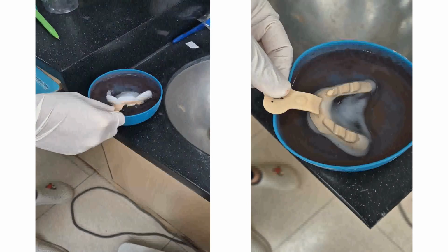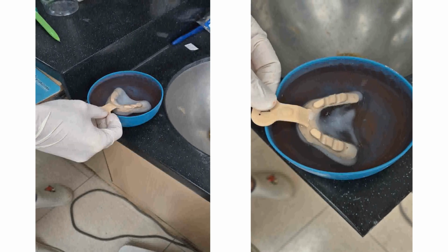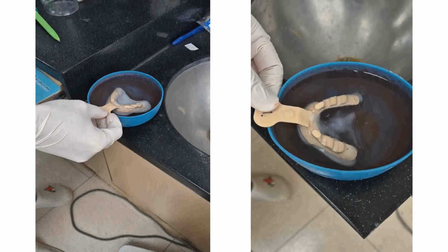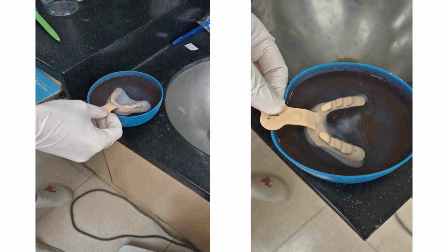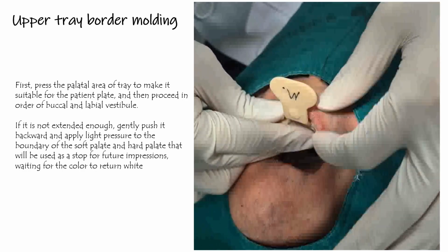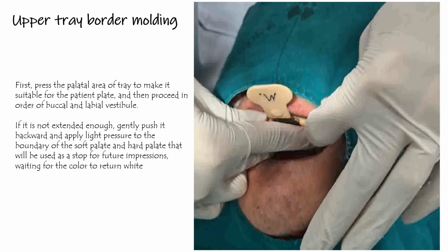When you place the JB tray in hot water, it softens in less than a minute at about 70 to 75 degrees Celsius. Please use the provided thermometer to ensure the water remains above 70 degrees Celsius. After about a minute, the tray becomes fully transparent, indicating it's ready to be inserted into the patient's mouth.